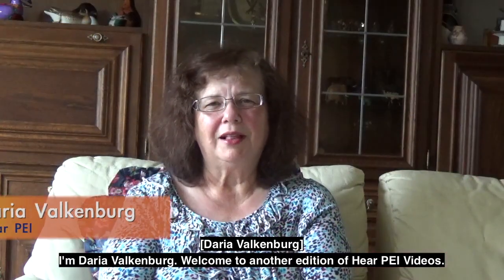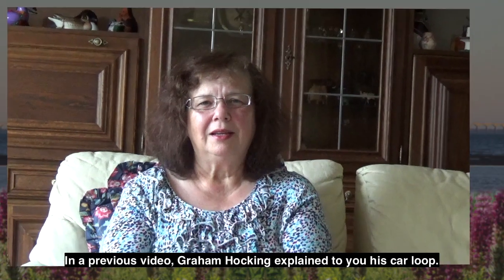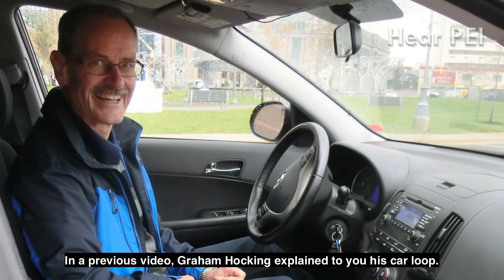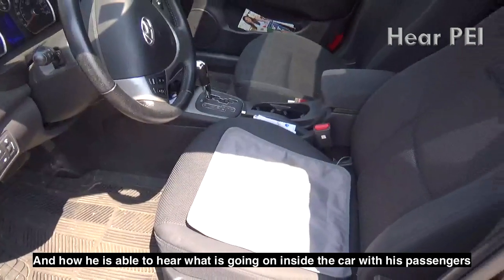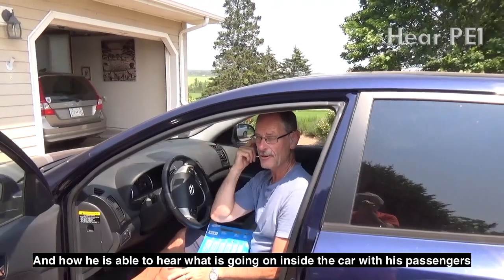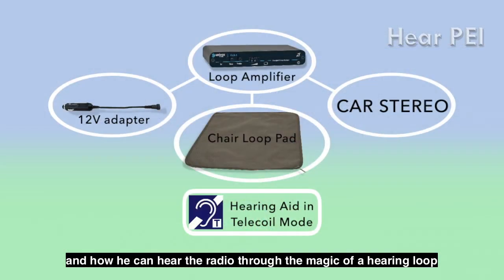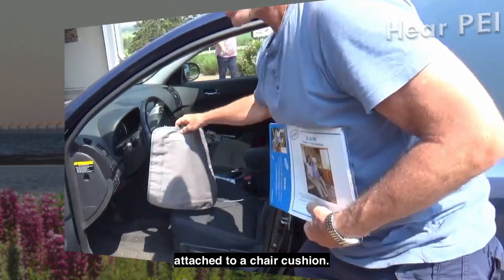I'm Daria Valkenberg. Welcome to another edition of Hear PEI videos. In a previous video, Graham Hawking explained his car loop and how he's able to hear what's going on inside the car with his passengers and how he can hear the radio through the magic of a hearing loop attached to a chair cushion.